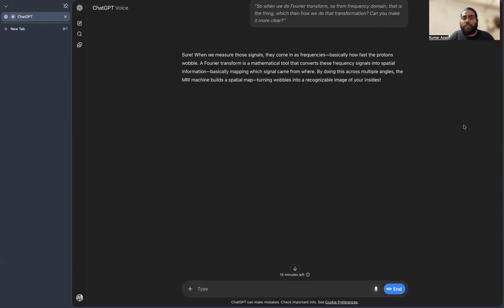I ask specifically because the Fourier transform has some form like minus infinity to plus infinity of that function and some exponential oscillating term. So given the radio wave frequency, we put that into the Fourier transform, and then which domain do we transform, and what limit do we set?